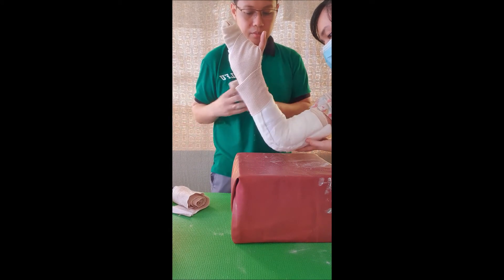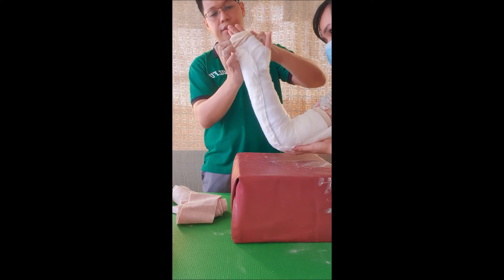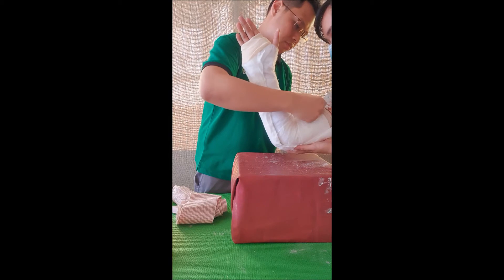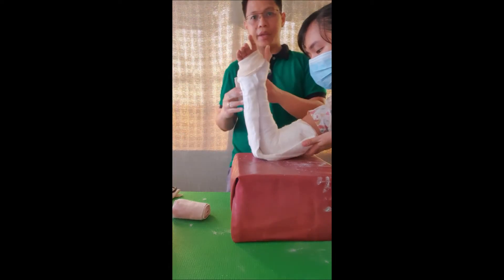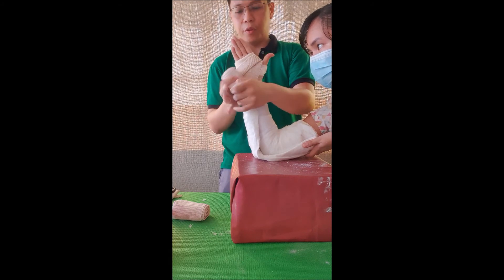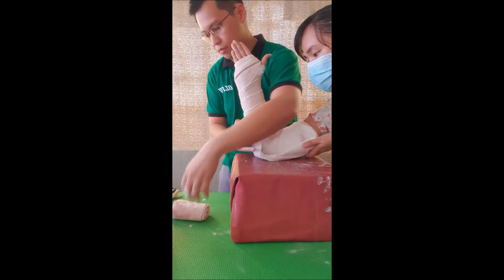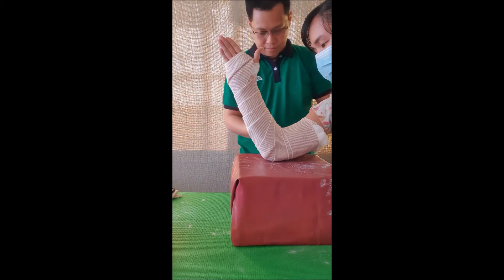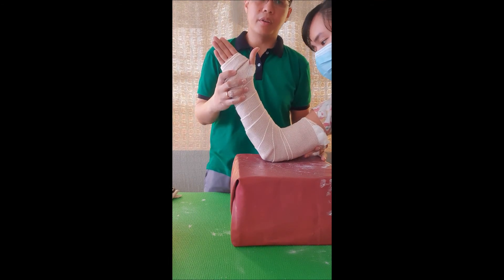Ask your assistant to hold on to the mold, then adjust your stockinette over the ends of the mold. We are now ready to reapply our elastic bandage. This step does not require you to apply it tightly — just place it as comfortably as possible for the patient. The only purpose now of this elastic bandage is to keep the mold from falling off. Secure it with a pin or adhesive. That is the proper application of a long arm posterior mold.